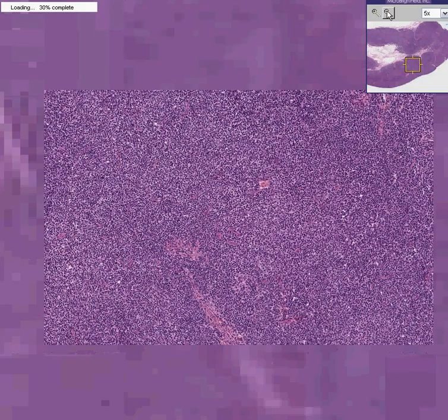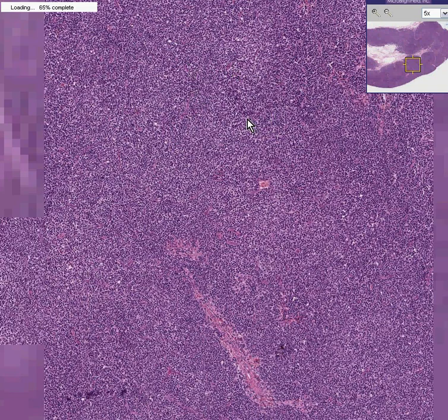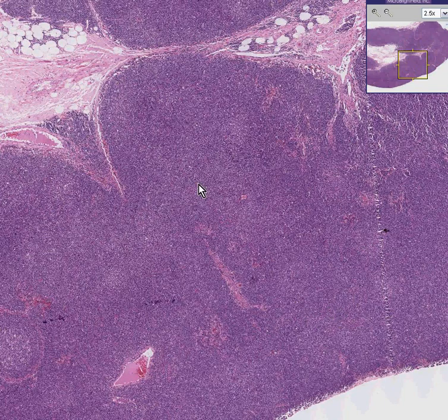But once again, it's a lymph node in which there's no differentiation of follicles towards the outside and medullary cords and sinuses towards the inside. There's no subcapsular sinus, but they're all lymphoid cells. By definition, you just diagnose yourself another malignant lymphoma.